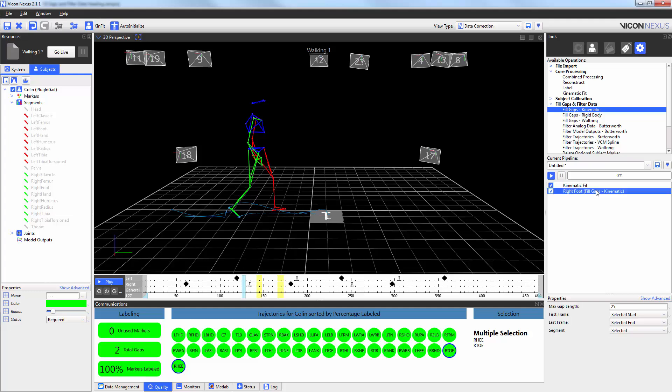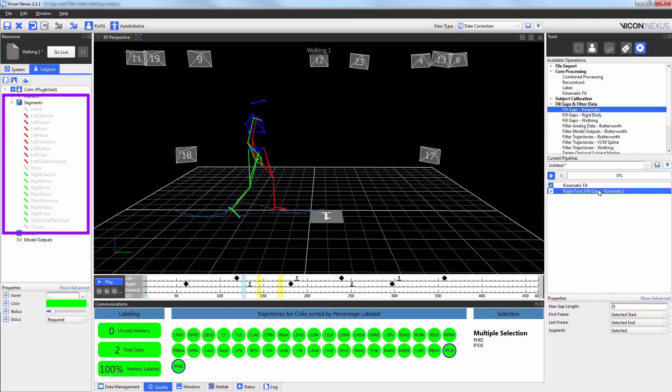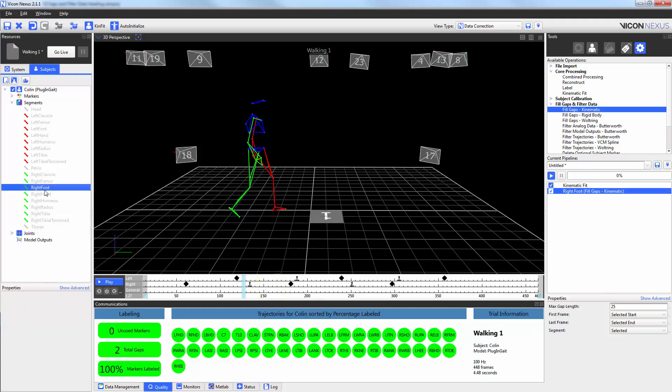In this example, I'm going to keep my max gap length to 25 frames. But like before, this time I'm going to choose my segment from my segment list. And in this case, it's the right foot. I'm also going to turn off my macro.